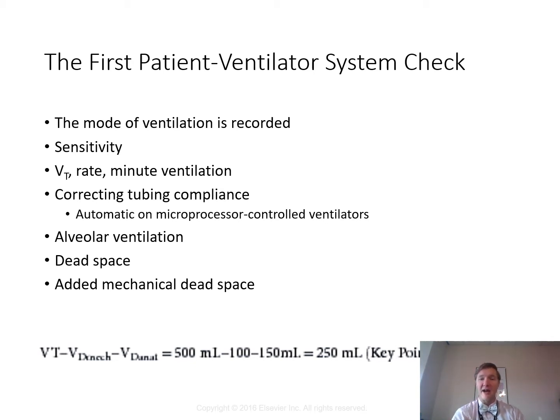There's another mode out there called airway pressure release ventilation, or APRV. If the patient's in that, that would be a mode that you would put in there. Another mode that you could see is pressure support ventilation, volume support ventilation, CPAP, right, where we just do CPAP, no pressure support. So that means it's unsupported spontaneous ventilation. All those, the pressure support, volume support, CPAP, are spontaneous modes where the patient does all that work. We might help to overcome the ET tube with a pressure support of 5, but that's about it.